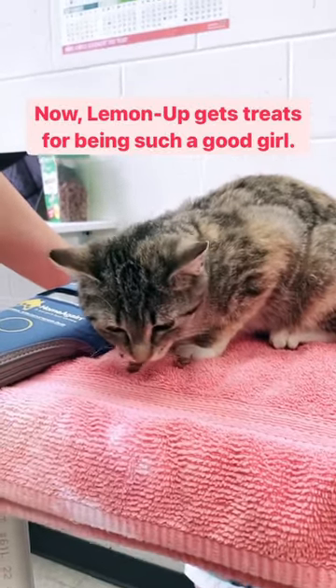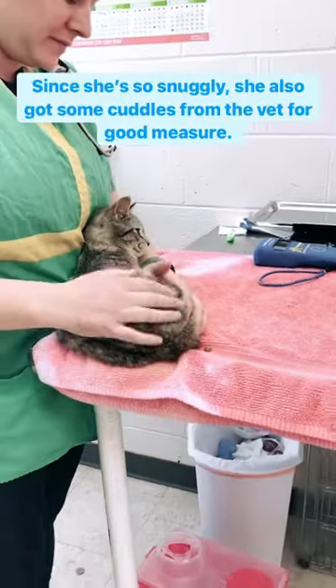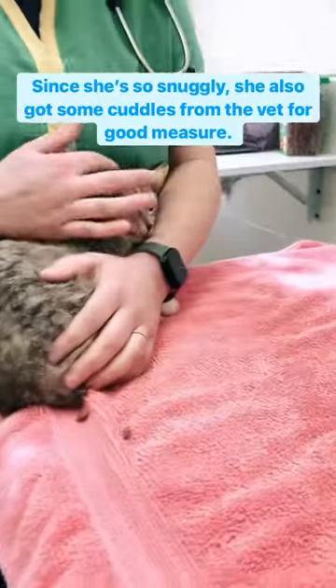Now, Lemon Up gets treats for being such a good girl. Since she's so snuggly, she also got some cuddles from the vet for good measure.